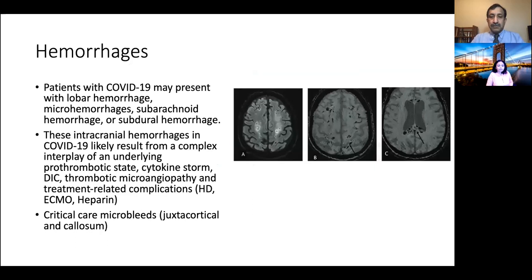Hemorrhages are also seen, and these could be multi-compartmental hemorrhages including extra-axial and intra-axial hemorrhages. There could be lobar hemorrhages, and also patients who had micro-hemorrhages, as seen in this example where you can see juxtacortical and corpus callosal micro-hemorrhages, most likely related to critical care microbleeds as described previously in critically ill patients.